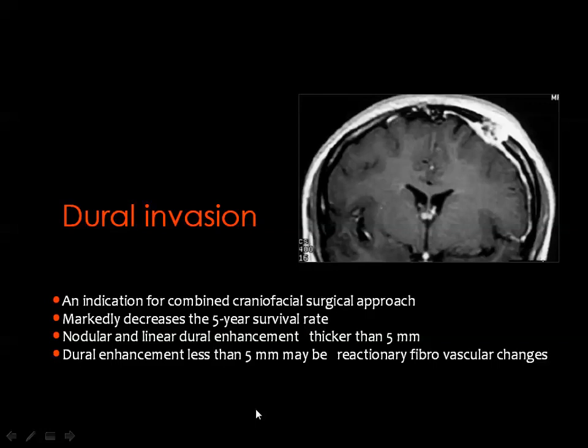Dural invasion is one of the major tasks of MRI in evaluation of skull base lesions, and this significantly decreases the 5-year survival rate.